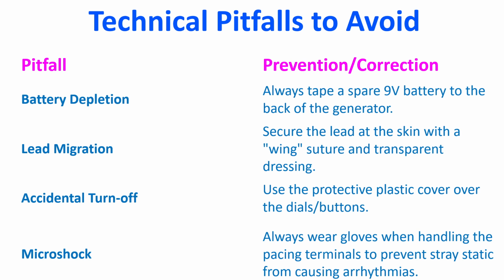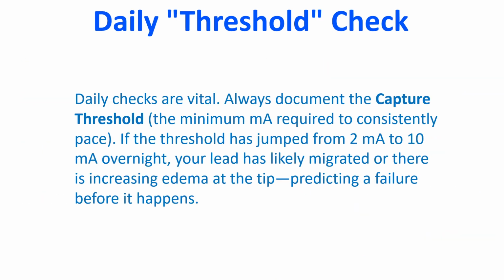Microshock. Always wear gloves when handling the pacing terminals to prevent stray static from causing arrhythmias. That is, static electricity from your fingers can be conducted from the pacing terminals to the lead tip in the heart and cause arrhythmias. Daily checks are vital.